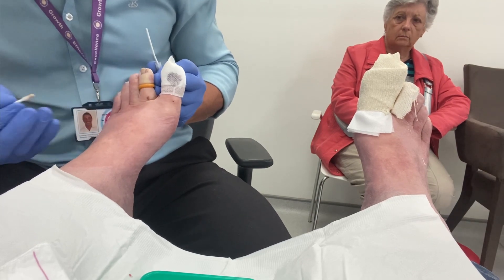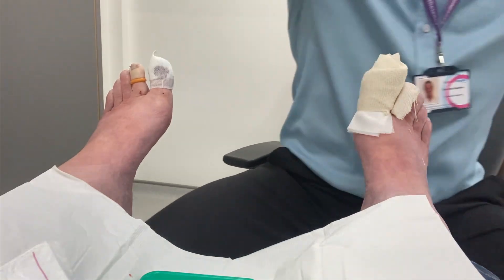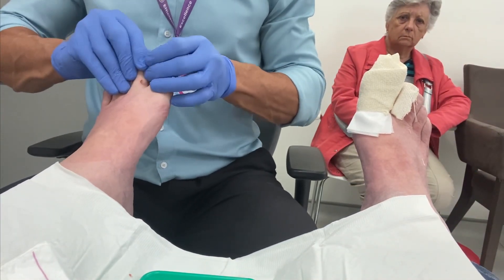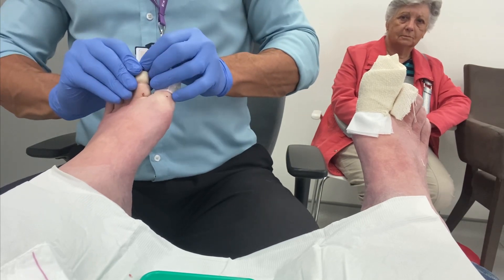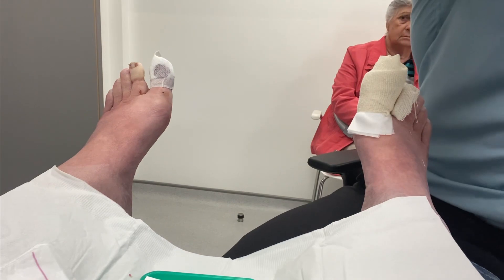This patient will return to clinic in 3 days time to have his dressings changed and ensure there are no complications. Removing the tourniquet and allowing the circulation to return to the toe before dressing it.